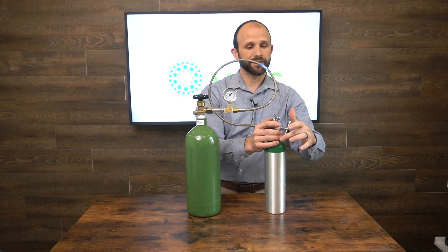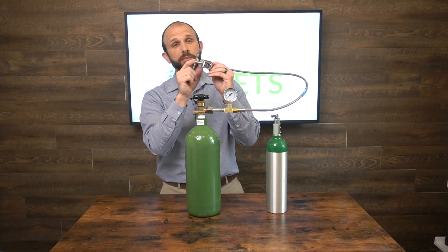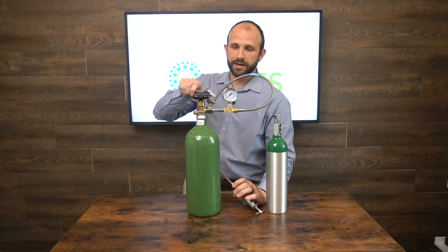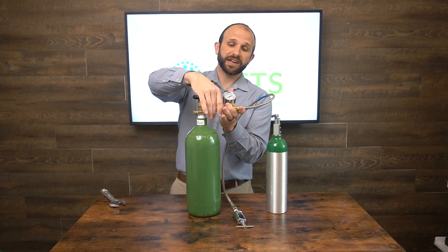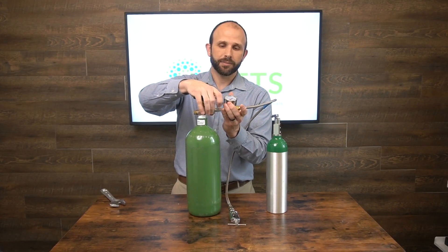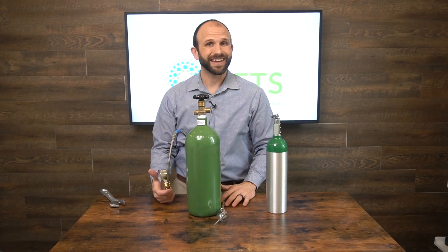If you've left the valves open you'll hear a lot of oxygen escape. Quick note: there's a little rubber washer in here — if that falls off you're going to get a lot of oxygen escaping when you hook these up because it won't seal properly. Make sure that rubber washer is in there; if you lose one you can get them from us. That's all there is to transferring oxygen from one tank to another.